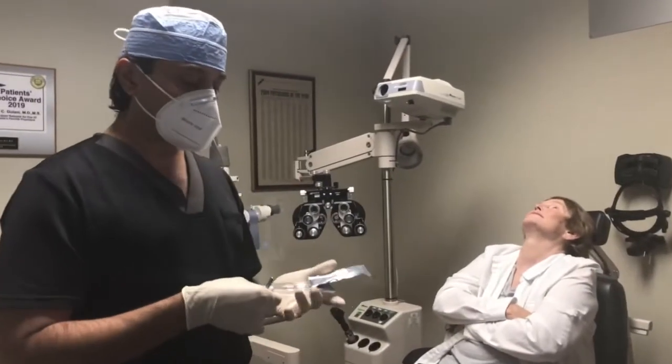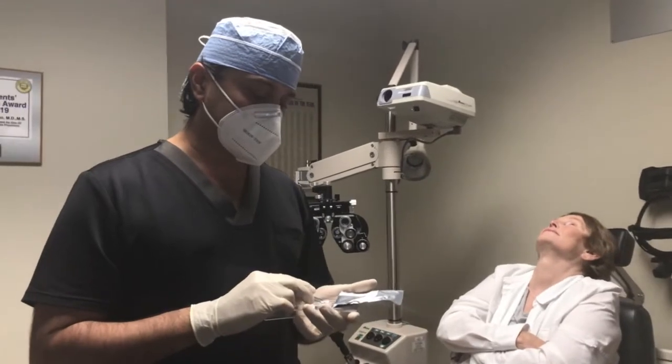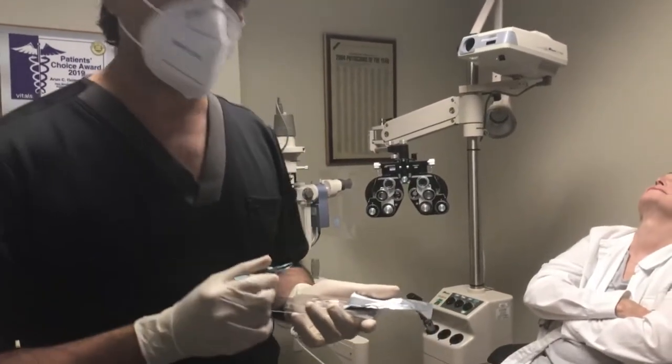For doctors, this is a Prokera Slim Ring. It literally comes in a prepackaged sterile application right here. I hold it with the forceps. For the patient, I put a numbing drop and a single drop of antibiotics.